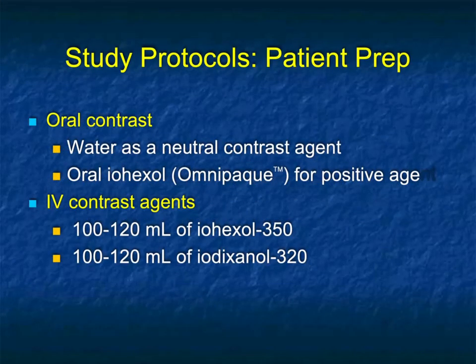Now, if I'm doing a dedicated liver protocol, I'll still give water. I want to distend the stomach. I want to get a good look at the stomach and bowel and make sure I'm not missing any pathology there. And water is easily tolerated. I give essentially 750 to 1,000 cc's of water within 30 minutes of the examination.